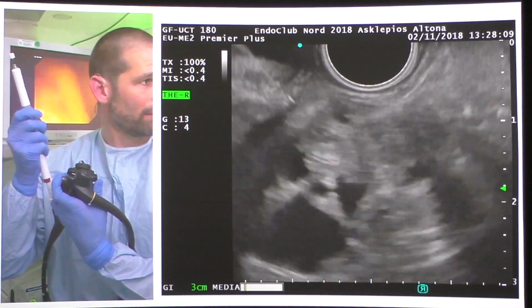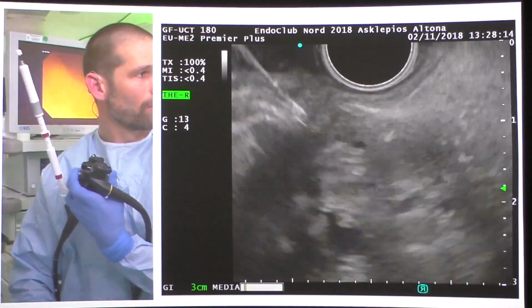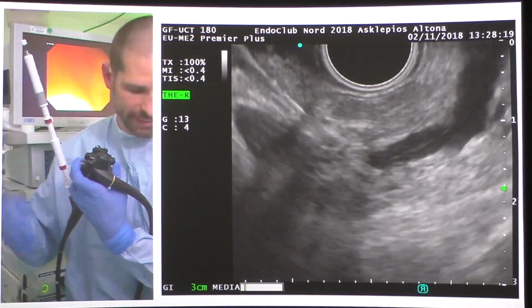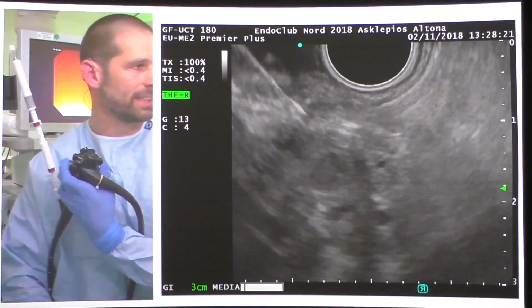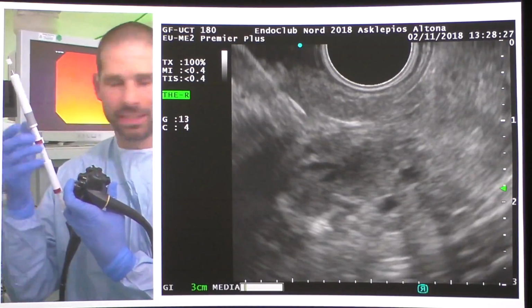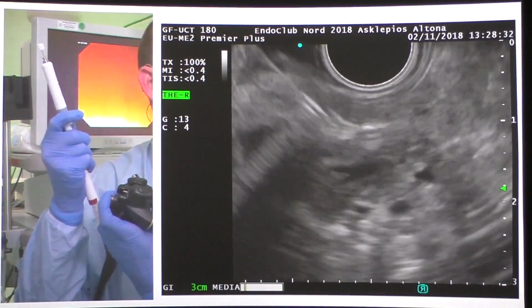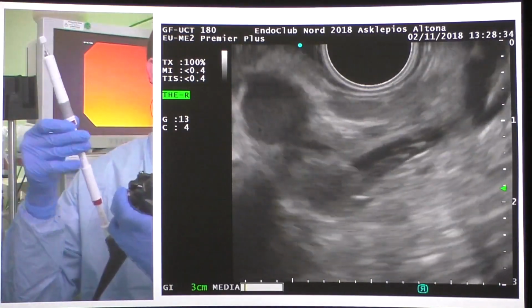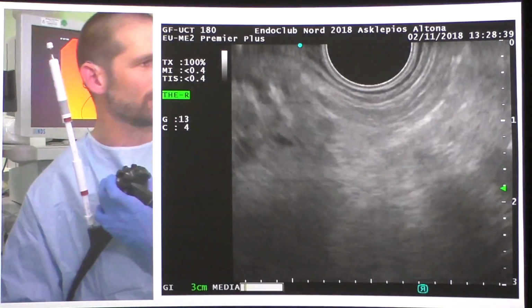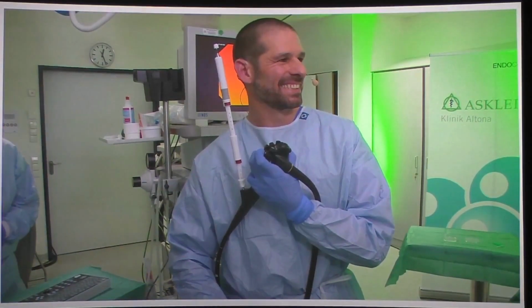Okay. I loaded the needle again and I tried to apply a little more pressure. But you see, I only push the wall of the stomach forward. Now, if it doesn't work now, I use a 22 needle because maybe in this position with a thicker needle, you can't enter. So I would reposition and perhaps you come back later after the ERCP. Otherwise, I've recorded. Yeah, good proposal, 22 needle.